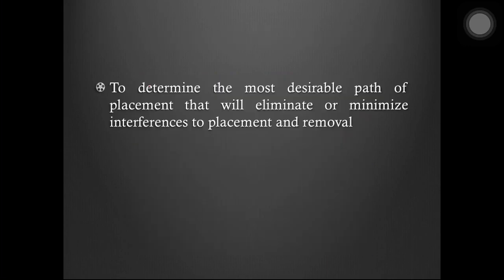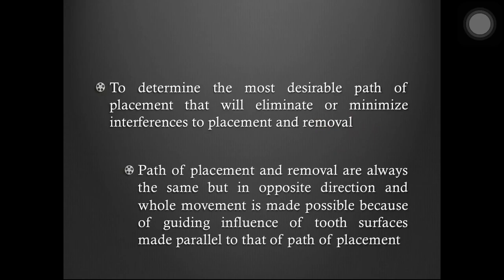The purpose of surveying the diagnostic cast is to determine the most desirable path of placement that will eliminate or minimize interferences to placement and removal of the denture. Path of placement and removal are always the same but in opposite directions, and the whole movement is made possible because of the guiding influence of tooth surfaces made parallel to that path of placement.